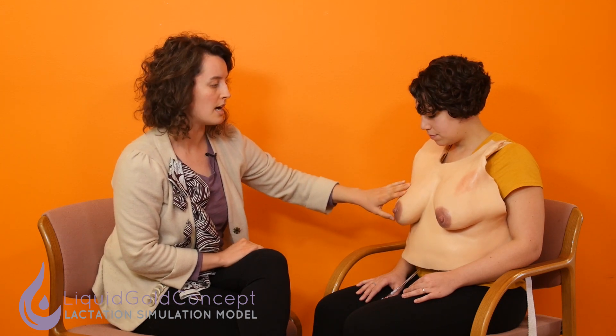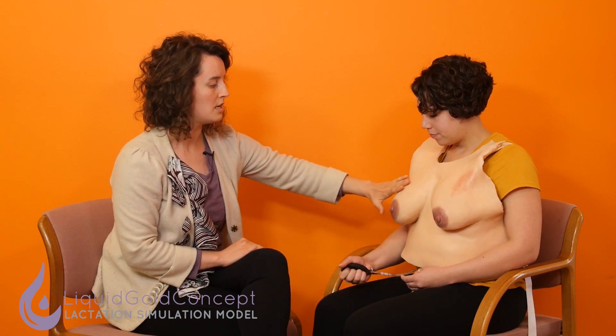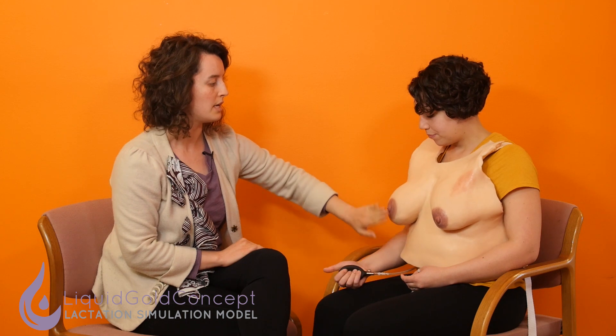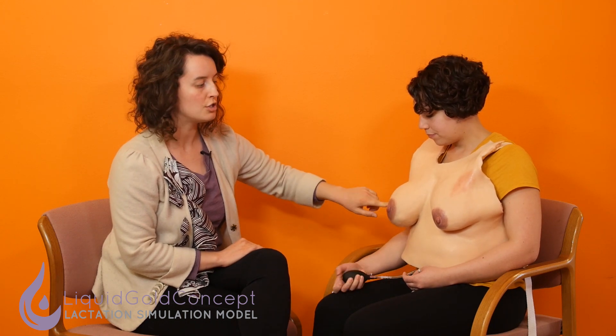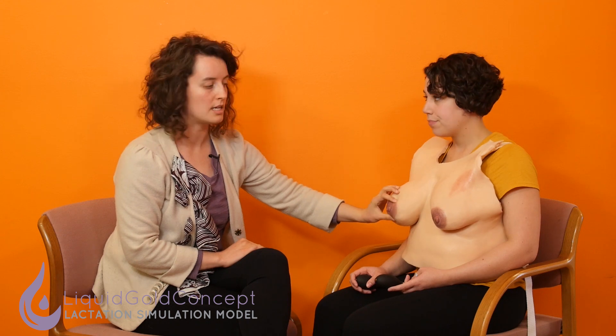The other features of the LSM include engorgement. Sam can show us how to do that — you basically pump up the breast, and you can see as she's pumping it, it's getting a lot more engorged and veiny. You can do that with just one breast to show oversupply, or with both simultaneously to simulate a postpartum mom at day three to five. And then of course you can practice hand expression on an engorged or non-engorged LSM, and we've already shown some great opportunities for flange sizing and breast pump use.